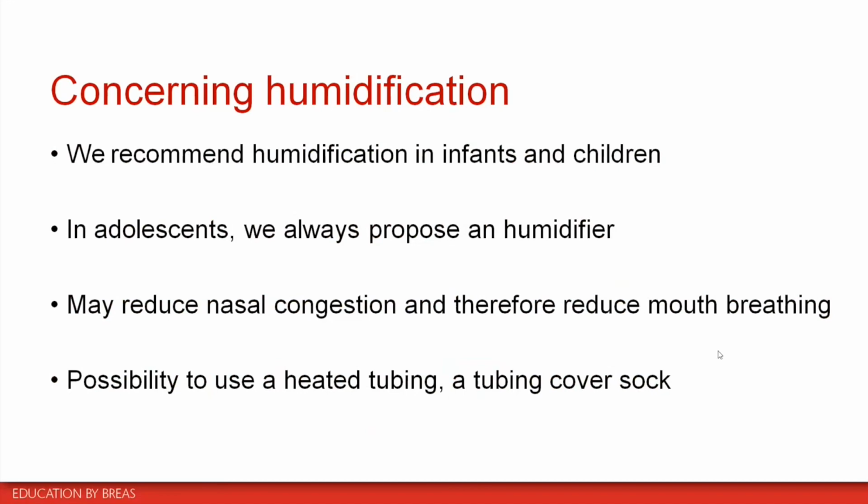In adolescents, we usually always propose a humidifier. We have no experience of adolescents not using it, but it is much easier to ask the adolescent, if he can speak, obviously, how he feels without a humidifier, and if everything is okay like this, and the NIV or CPAP is well tolerated, you can do without, but our practice is to always propose it. And as I said just before, this is important because that may reduce nasal congestion, therefore reduce mouth breathing. And this is an important point to make acceptance of CPAP and NIV.